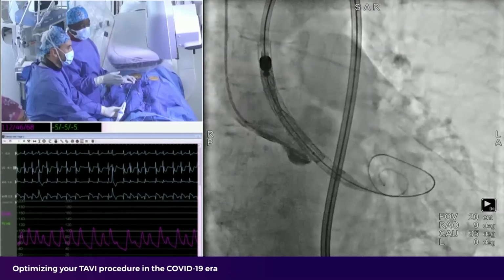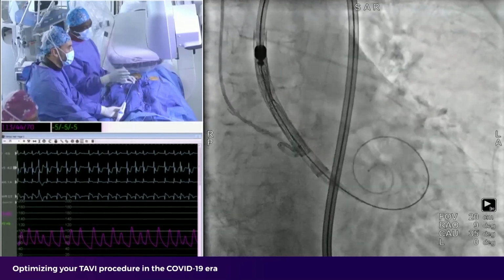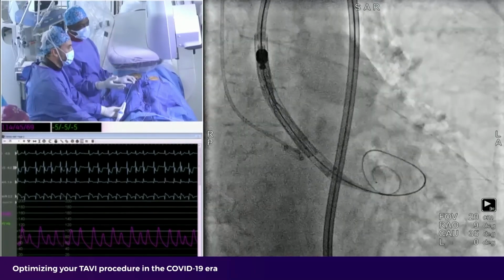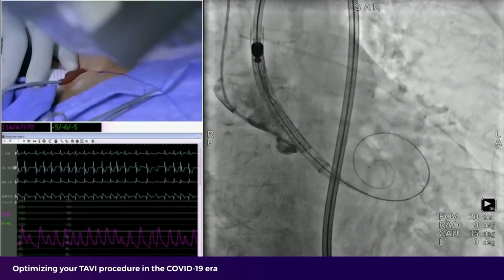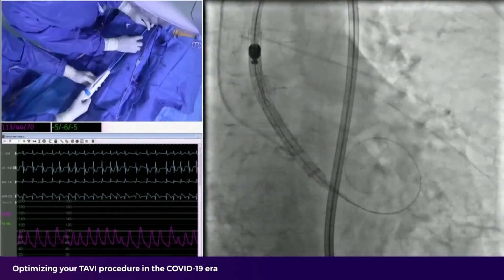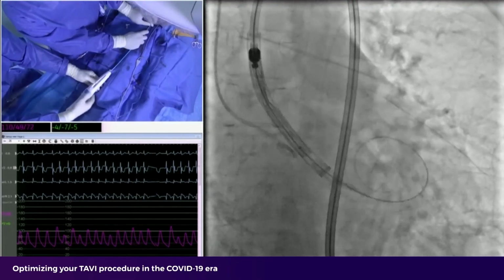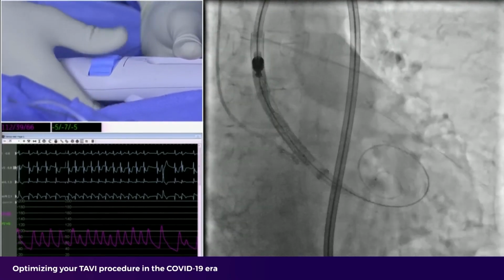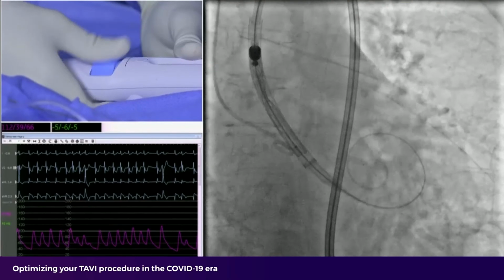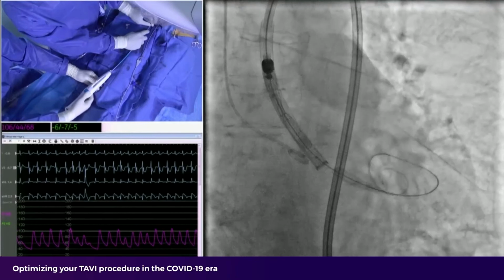Here we have the issue of a risk of AV block, so we're going to be a little bit higher than we do usually. Usually you put that marker at the annulus and then you start the deployment. Here we're going to keep it maybe 1 millimeter above the annulus, keeping an eye on the distal edge of the stent frame. What is really important is that we don't have major parallax, so I think we can start to deploy. Okay. We don't need to correct the angulation yet. We're going to see once the device extrudes. And the goal definitely, once the device will be exiting the sheath, will be to go very slowly. Yeah. Nicolas is going to do that.